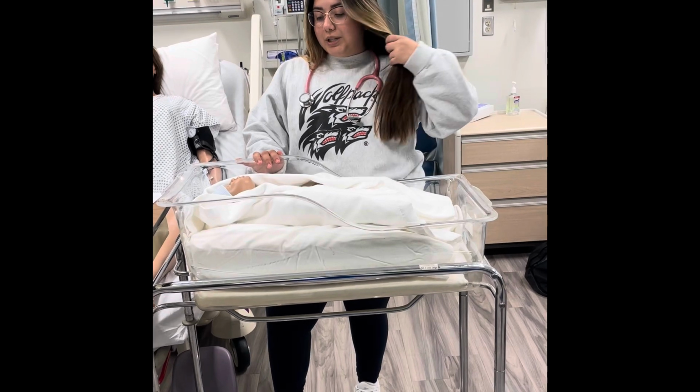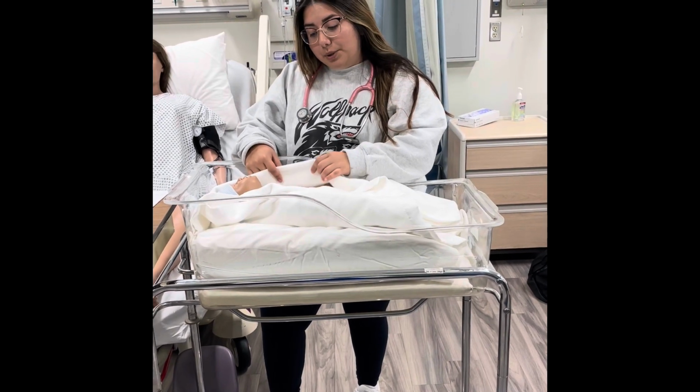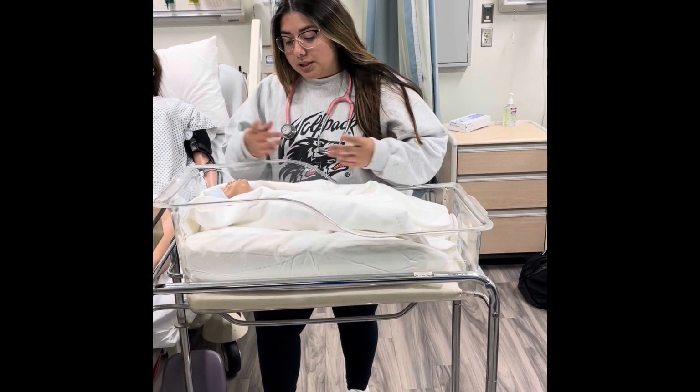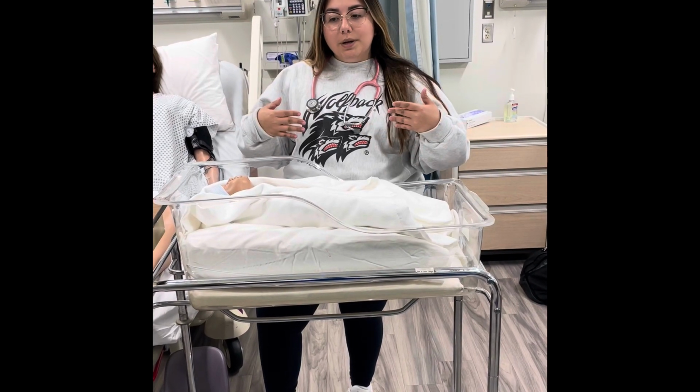One of the first things we're going to check is vital signs. We're not going to check the blood pressure unless we really need to. Right now, we're just going to check the heart rate, respirations, and temp.